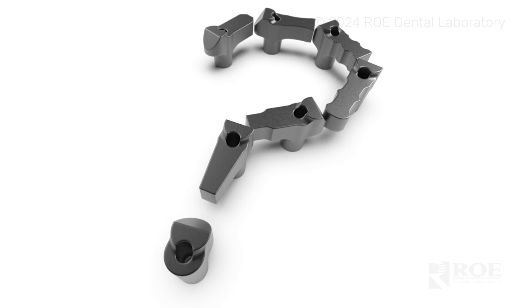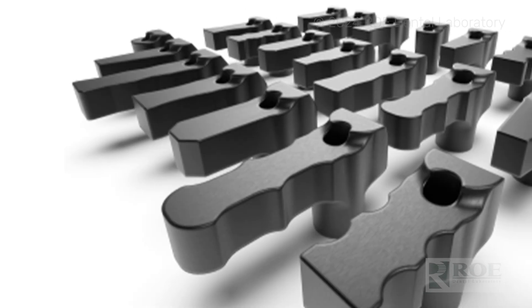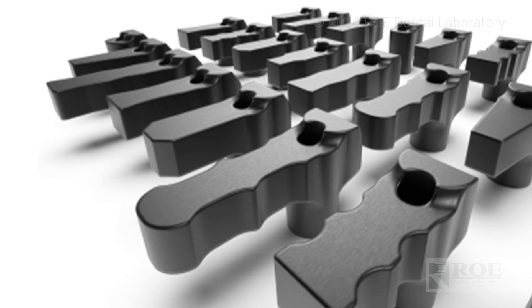The ArchBridge is a series of titanium scan bodies. There are nine individual scan bodies, each shaped a little bit differently for ease of scanning. It comes in a set of ten, so there's one duplicate in there. It uses an iOS workflow — just your intraoral scanner — and you're going to get direct-to-multi-unit abutment restorations for you to print in office with just these scan bodies.